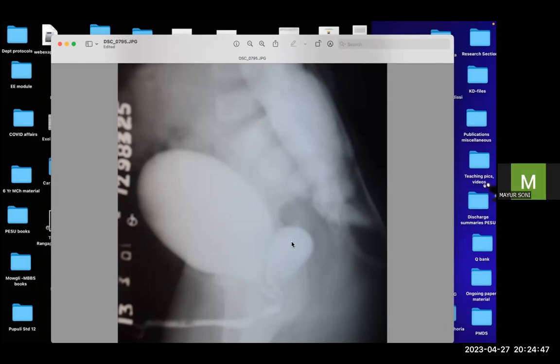So this is a typical position where you find a persistent prostatic utricle, or a Mullerian derivative. So what do you think this is? Can you make out, is this a male or female? It's a male, the typical male urethral anatomy, and a persistent structure there looking like a persistent Mullerian remnant, right? Yes. How do you investigate this child?